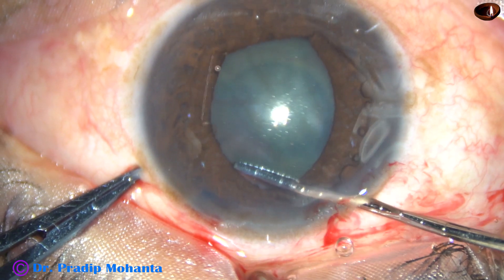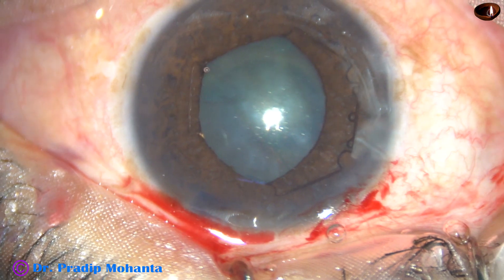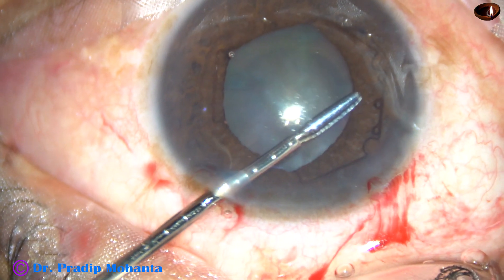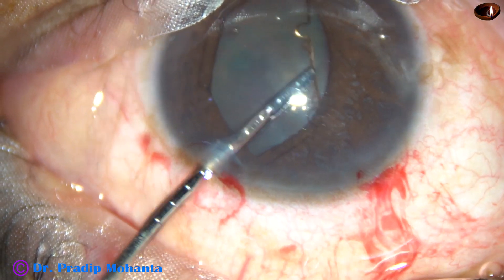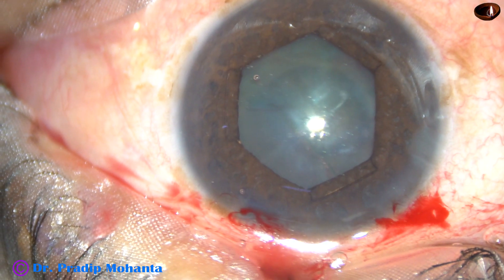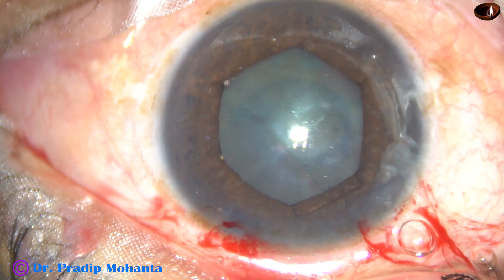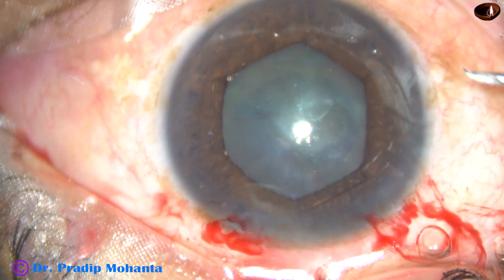This is the flange at one o'clock — it is tucked. Have you noted that the B-hex forceps are through the main incision, and now the B-hex forceps are being used through the left paracentesis. And the flange at ten o'clock has been tucked. Now it's time to do capsulorhexis.